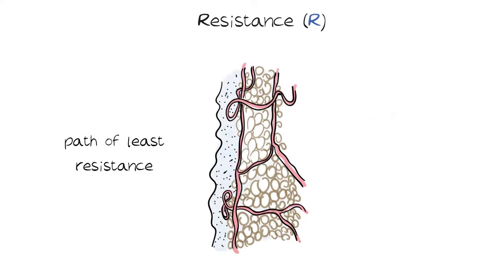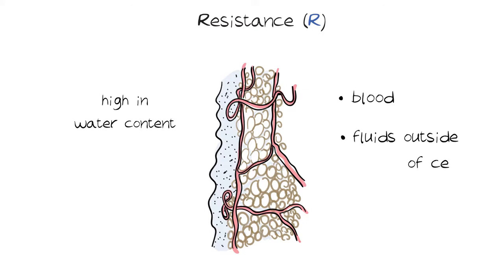The path of least resistance would be any body component high in water content, including blood, fluids outside of cells, and muscle.